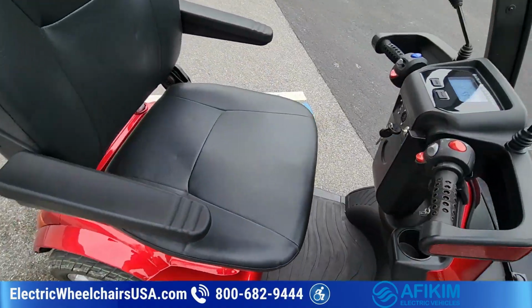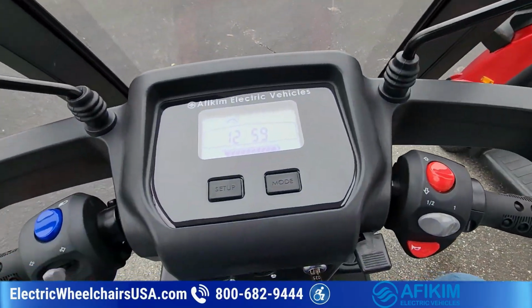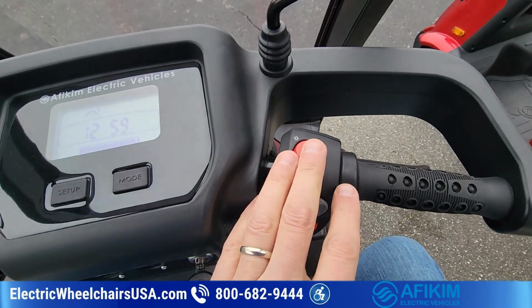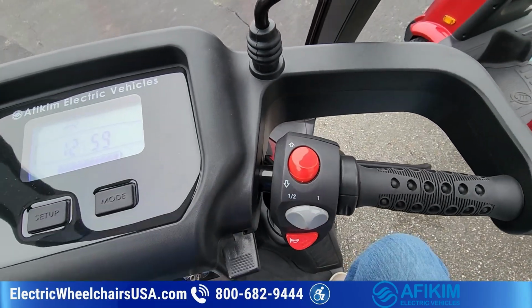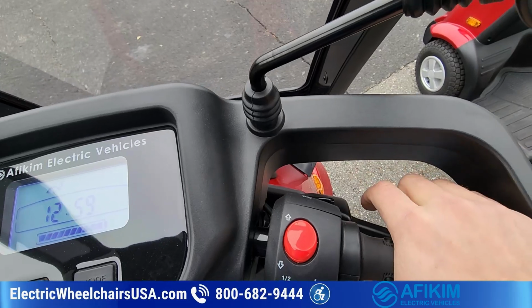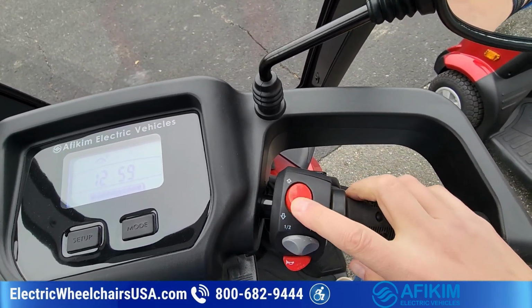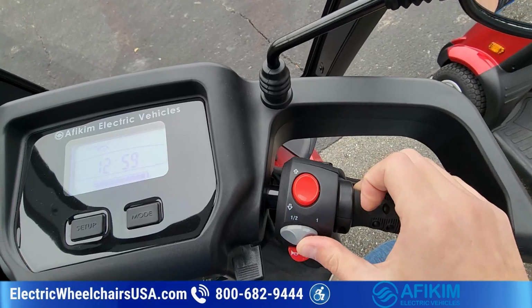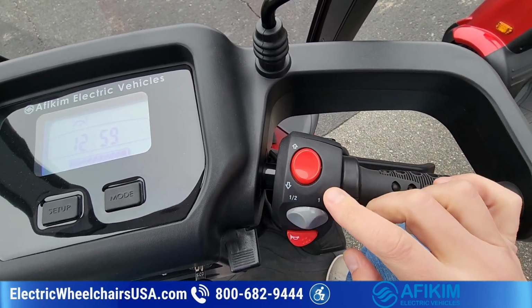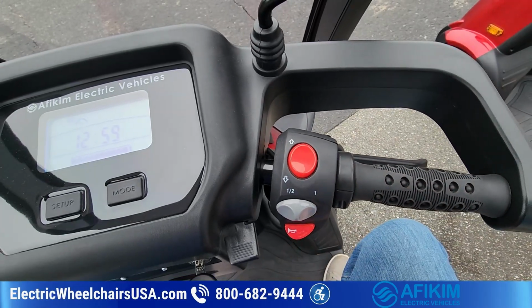S model, a little bit different. So you can see it looks different, right? The controls on the right side, so you have, this is your throttle. It's how you accelerate. This is your forward and reverse switch. This is your speed control. You have a half speed and then a 1 speed. 1 speed is 10 miles per hour, just like the C model, and that's how you cut it in half.